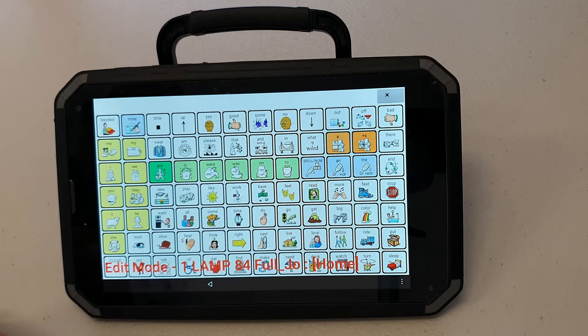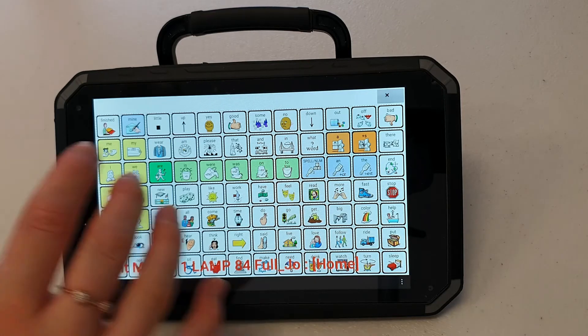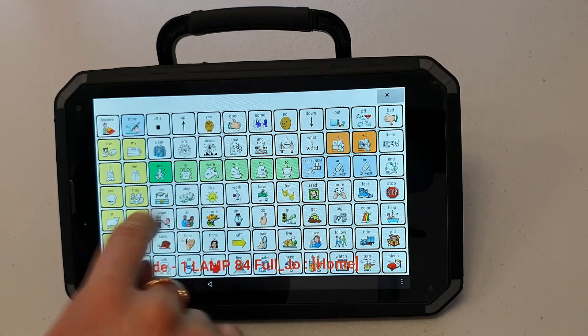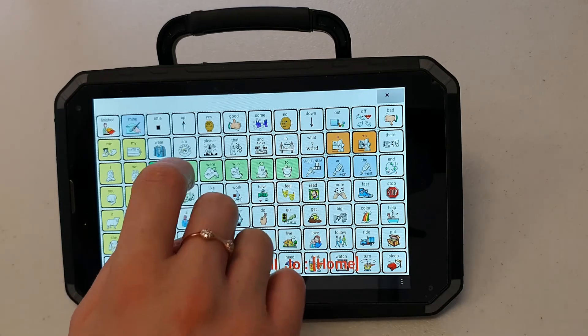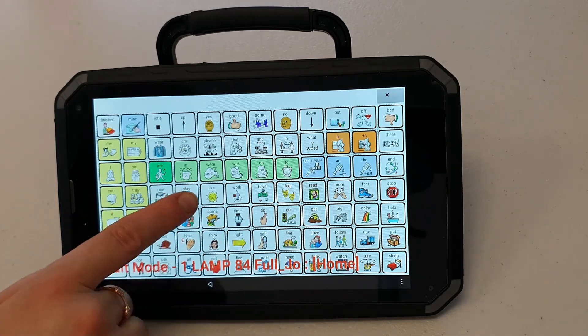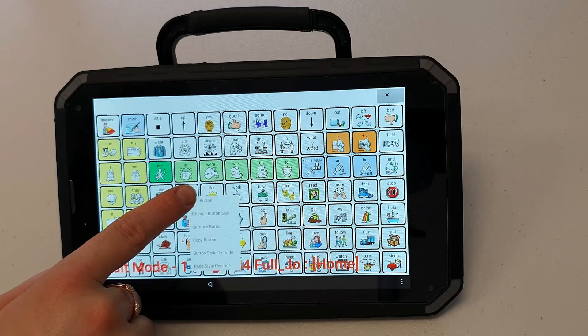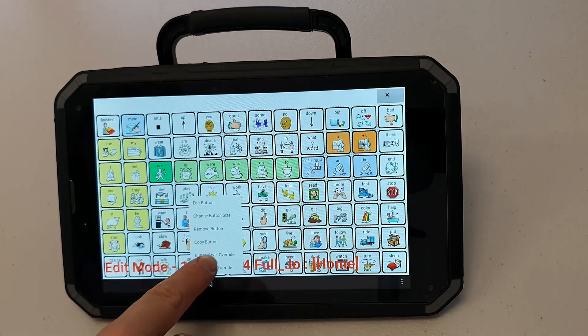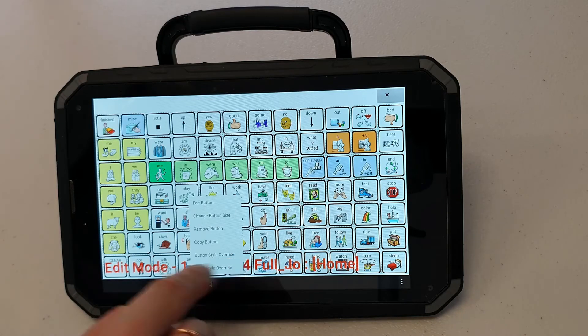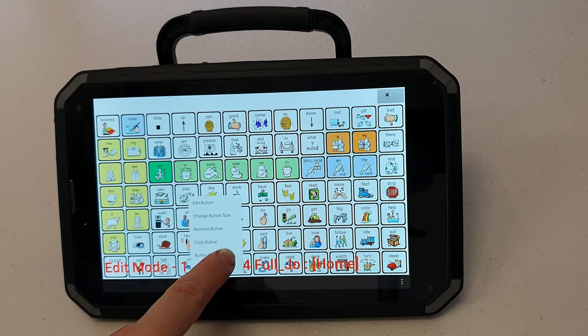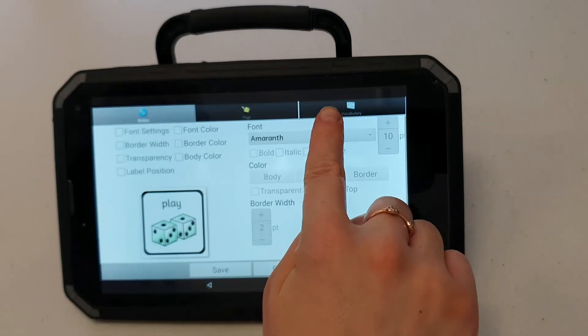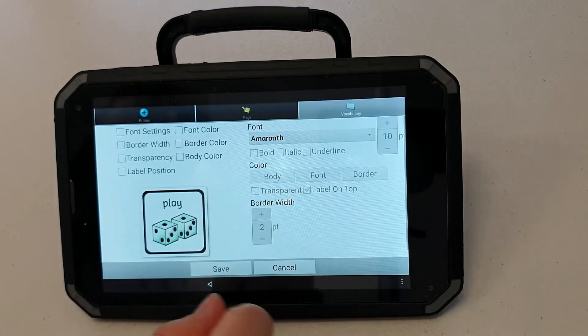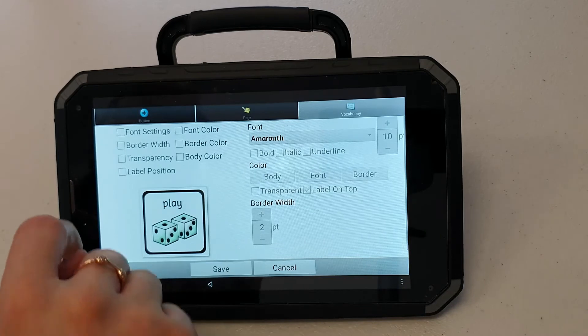It can be helpful to have slightly larger icons with less of a border around them. To change the border width of my icons I'm going to hold down any icon on my page and press button style override. The override just means that it will change every button in my lamp file. I'm pressing vocabulary so that all the buttons in the vocabulary file will be changed.